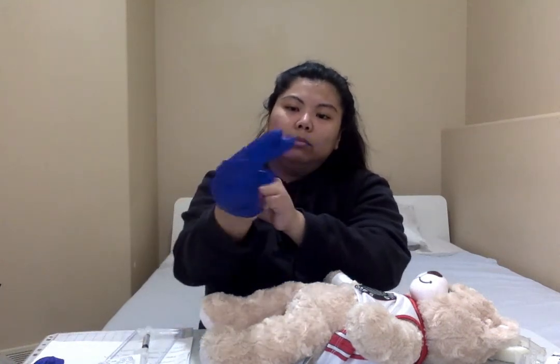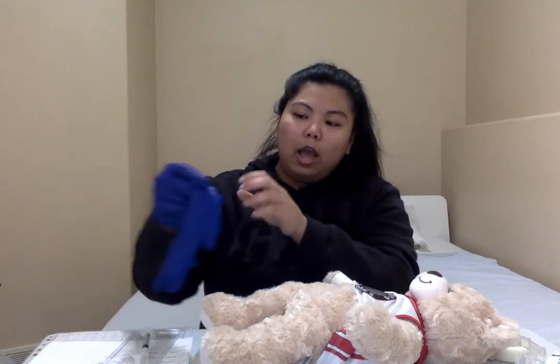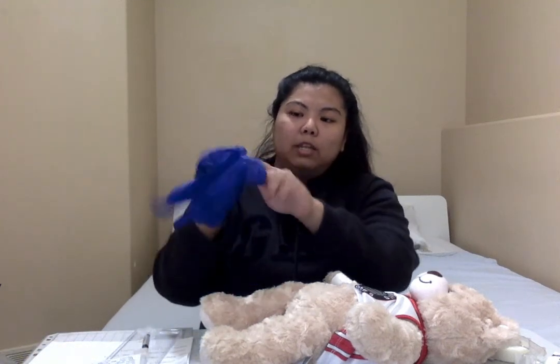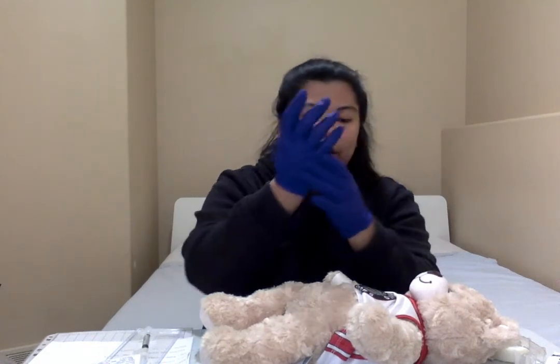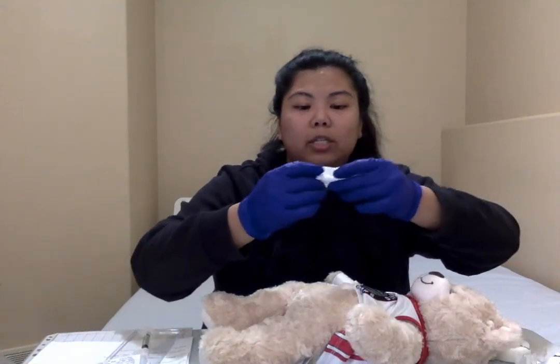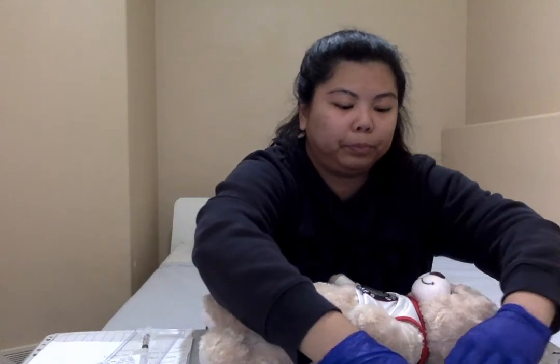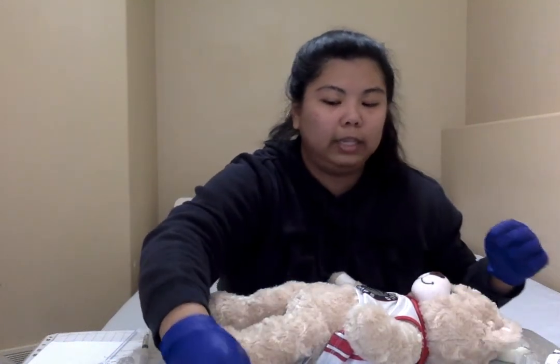Okay, so Jake, just getting ready here to administer the medication. I'm going to do hand hygiene again. And then I'm going to put gloves on. And then I just wanted to mention that for injection, we don't want to massage the injection site after we've administered the medication. So like I said, we shouldn't see any bleeding, but this will be just in case. I'm preparing my 2x2 gauze, and we'll put that over the injection site.